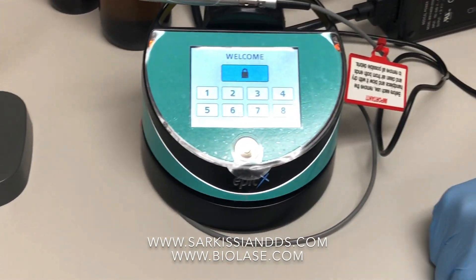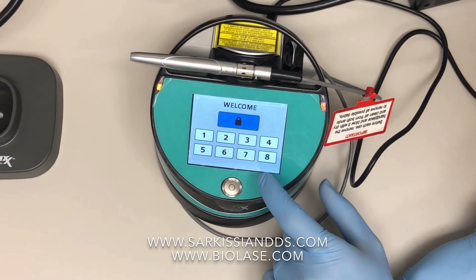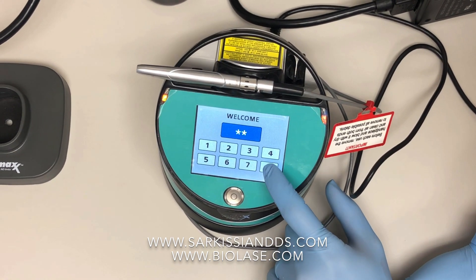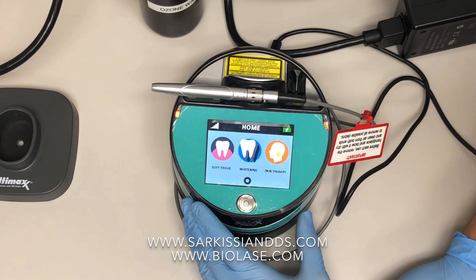The code to enter the unit is eight, eight, eight — it's three eights. You gave away our secret password!